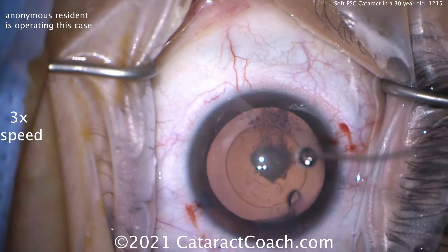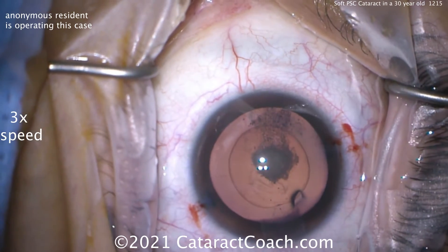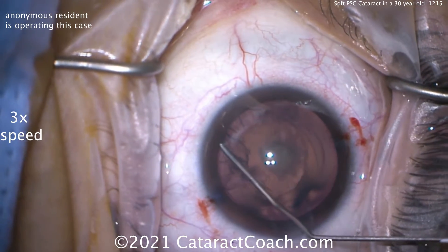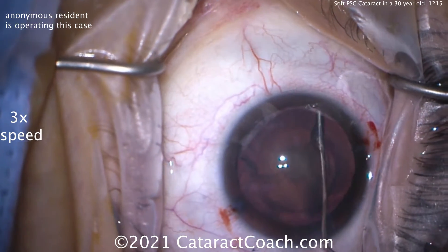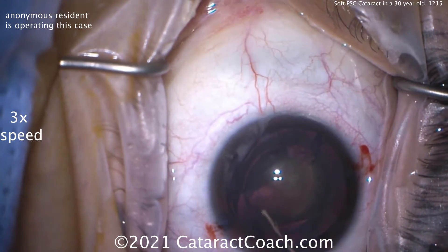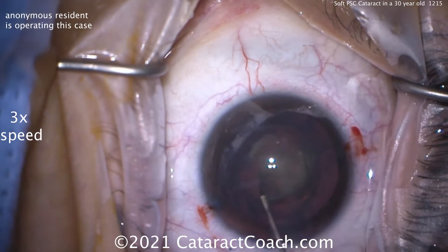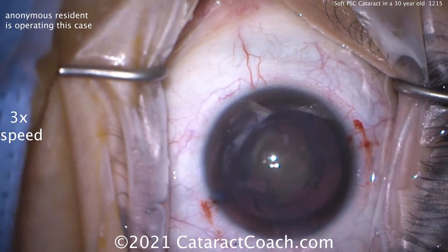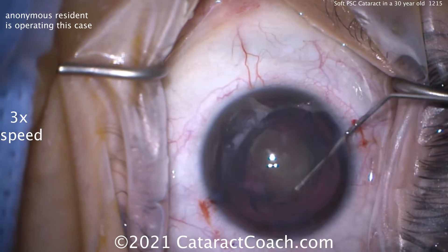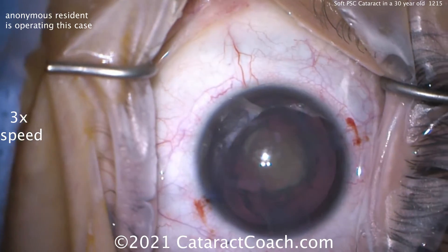Now, this is not a posterior polar cataract, but if it was, you'd have to be super cautious with hydrodissection. Here, we don't have to worry about that. The fluid wave goes across — it'll go just fine, no issue there. The nucleus comes up out of the bag. Great idea — get it out of the bag. Hydrodelineate. Put lots of fluid there. All this hydrodissection — fantastic idea. Why? This lens is soft, completely soft.